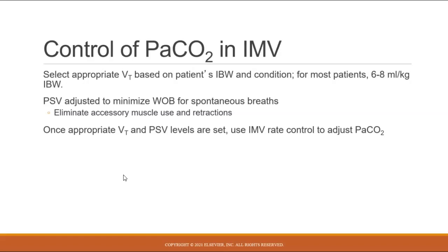Then I'm going to monitor my patient and observe, as I adjust the pressure support, what volumes they're achieving with that pressure support setting. So I'm going to be evaluating not only those mechanical volumes that the vent's delivering, but also those spontaneous volumes that my patient's achieving with the pressure support that I have set.